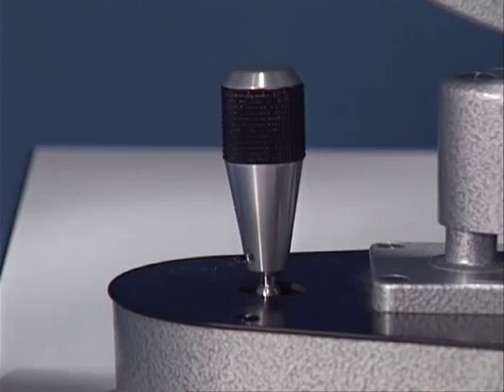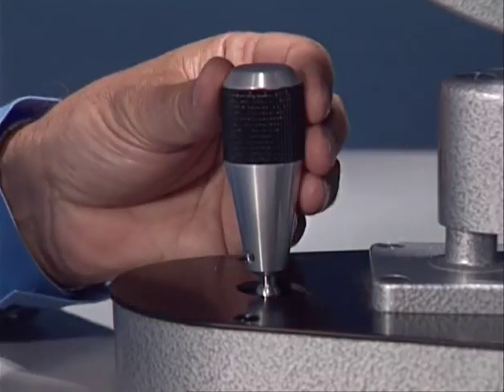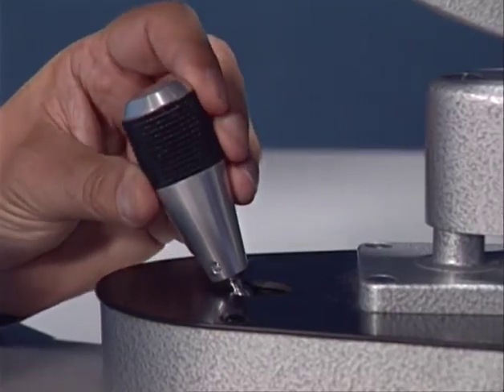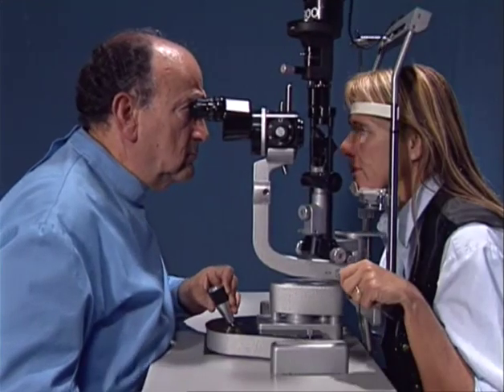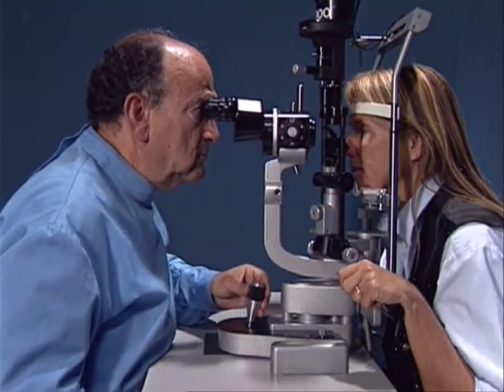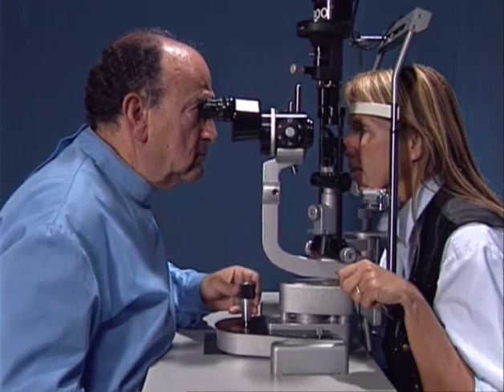To approach the patient's eye, the joystick is held maximally reclined in the direction of the examiner while shifting the slit lamp until the patient's cornea is in focus. By approaching the starting position in this way, all parts of the patient's eye can be reached with the slit lamp comfortably by just tilting the joystick.